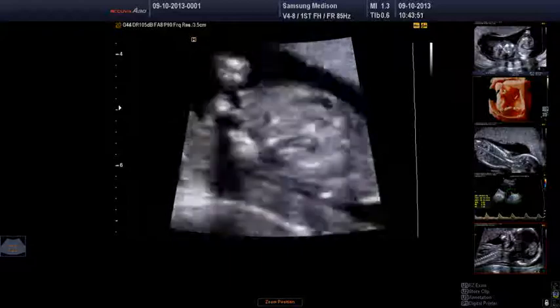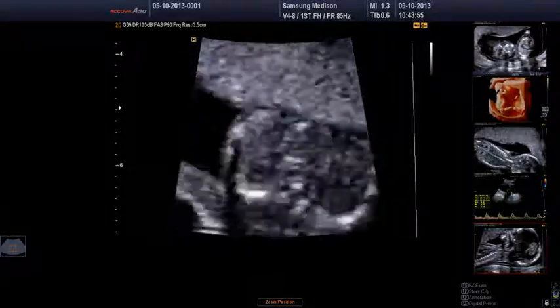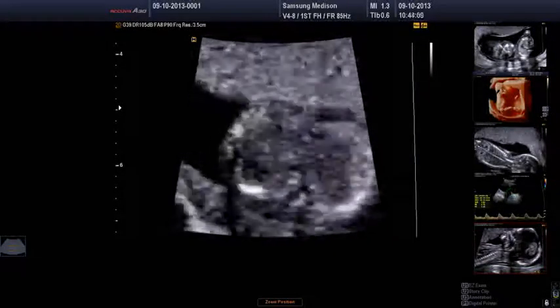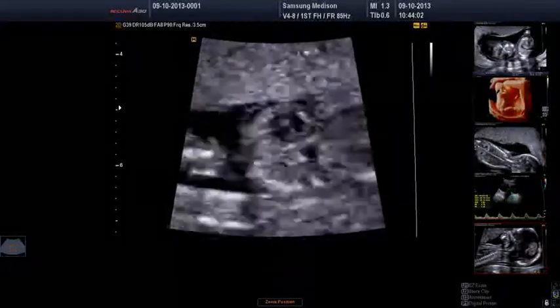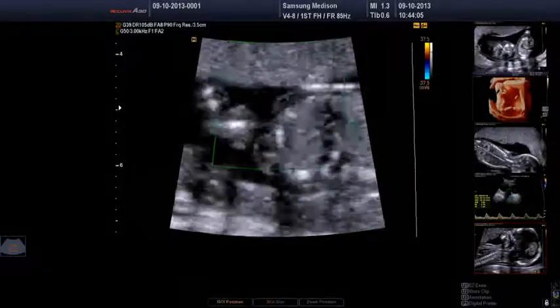Okay, so we can attempt to get a nice four-chamber view. Now the fetus is going to run away. What I might do is put colour on at an early stage, because I'll probably just be able to show you that colour is a very useful tool in the first trimester.